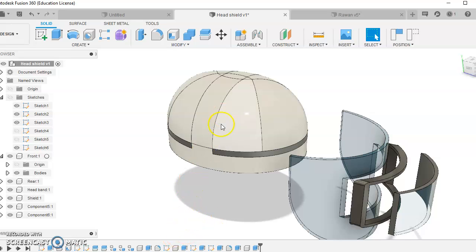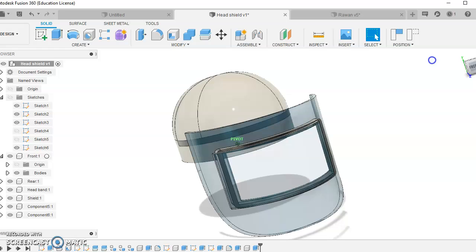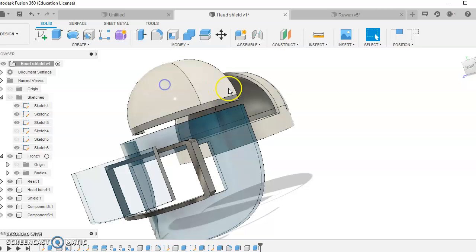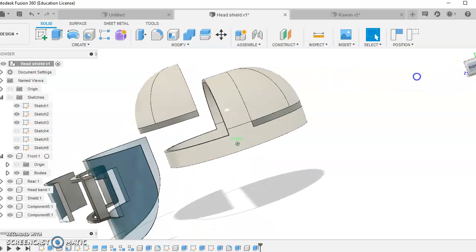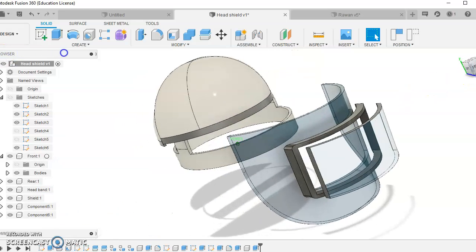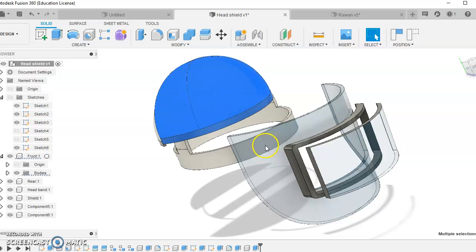Okay, what we're going to do today, we're going to look at the production of a face shield. So in this diagram here you can see I've got an exploded view of the actual headband, the front and rear part of the shield. I'll just show you that, rotate that round. You've got the visor at the front, and the visor is split into three elements. You've got the face shield, you've got the cover, and then you've got the digital heads-up display. So that's the one that's going to connect to the possibility of a Wi-Fi display or unit in the hospital.